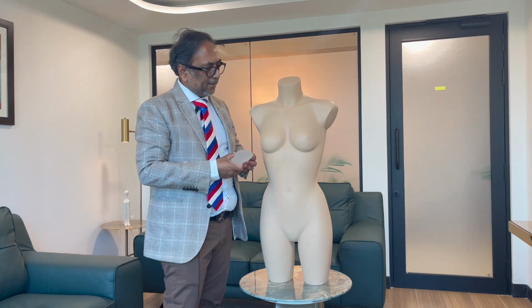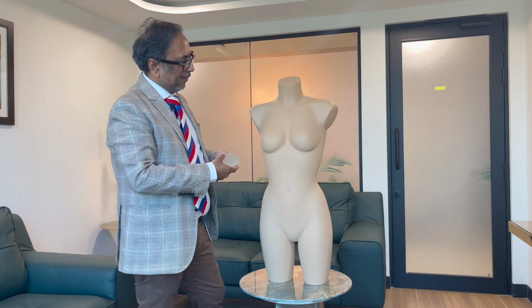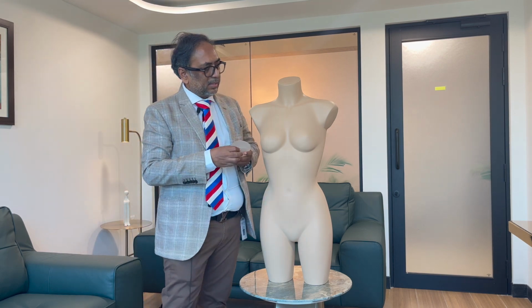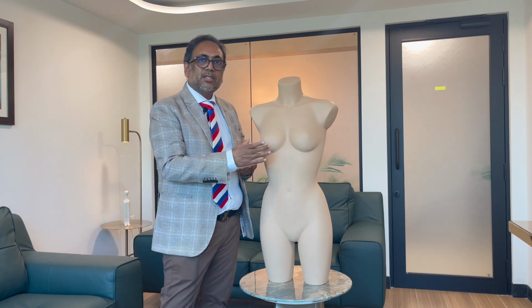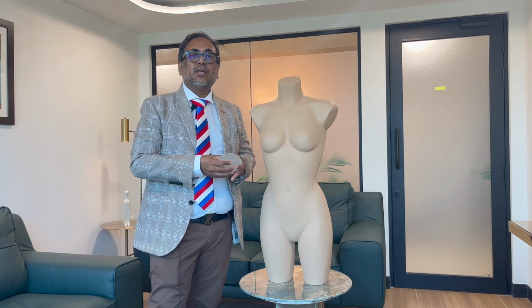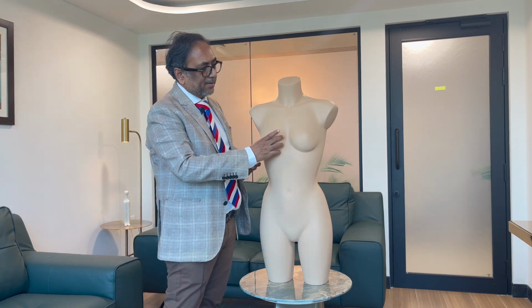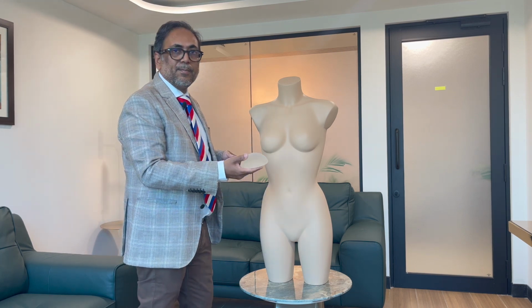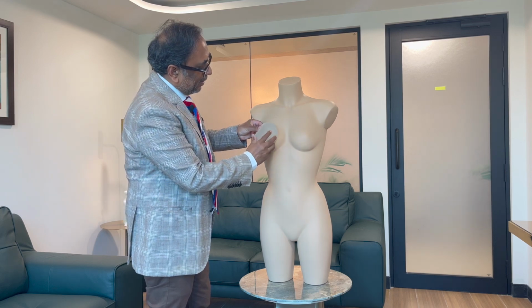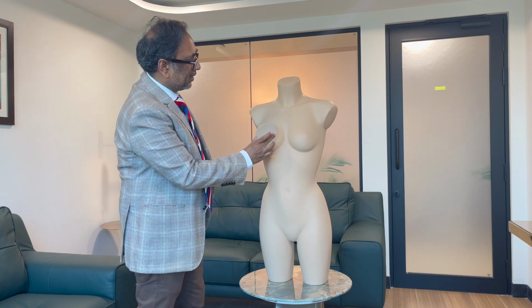Now, assuming that the base diameter which we first measured is 12 centimeters, and the woman wants, let's say, a moderate to high projection. What we do is, once we get the base diameter, we go back into our catalogs. Let's say I use SEBA implants, and I go into the SEBA catalog and look at the 12 centimeter base diameter and look at the various numbers. And here is a 12 centimeter implant which we put in, and it's exactly suiting, let's say, the breast, and it is in good proportions.